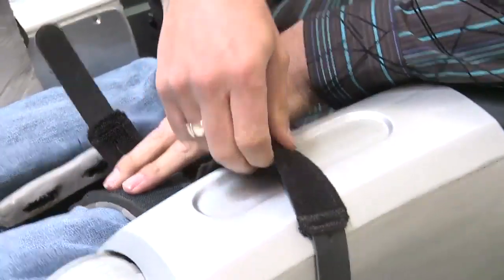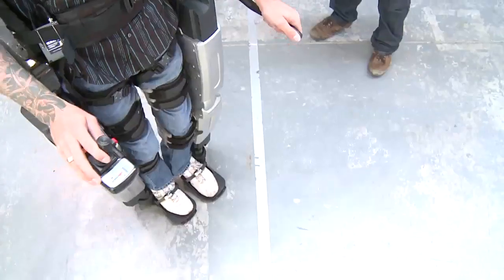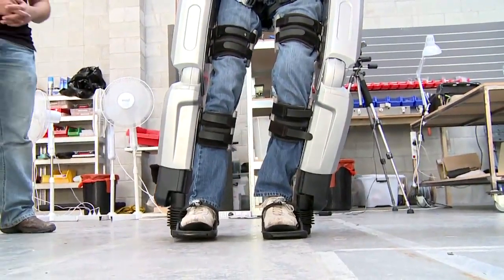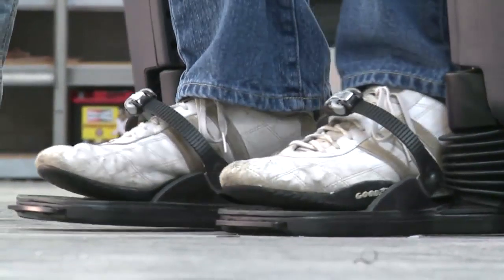So not long at all. Once you understand the movement of the machine — like understanding what action is happening in that step, so you're going to lean to the left before that leg lifts off — once you're used to all that and realise what's actually happening, it's really easy to get used to.